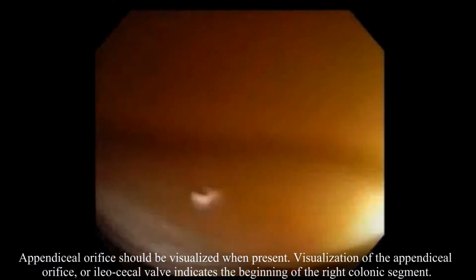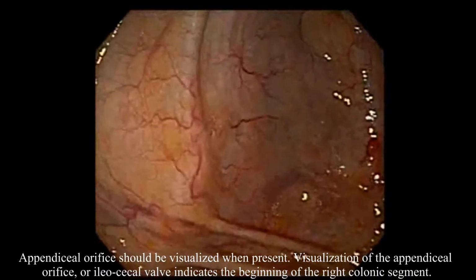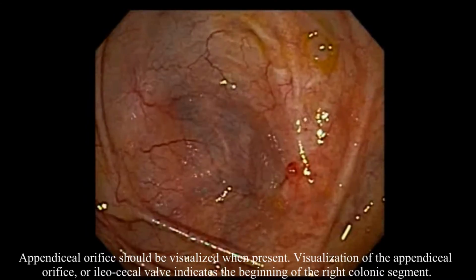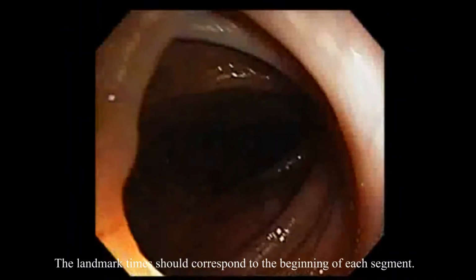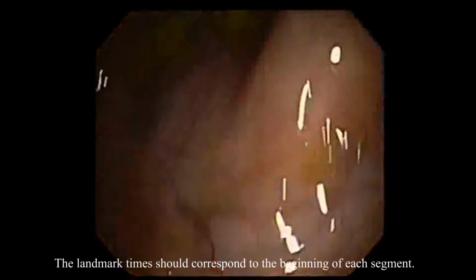Appendiceal orifice should be visualized when present. Visualization of the appendiceal orifice, or ileocecal valve, indicates the beginning of the right colonic segment. The landmark times should correspond to the beginning of each segment.